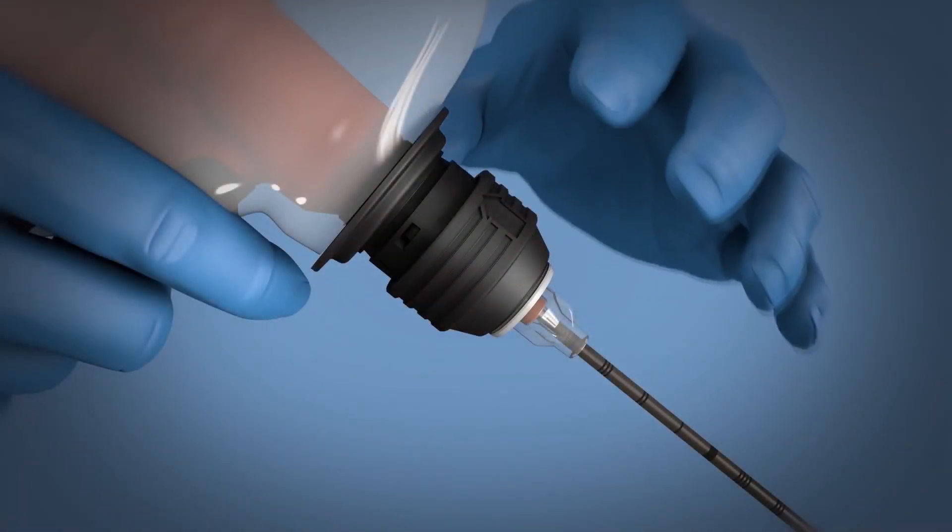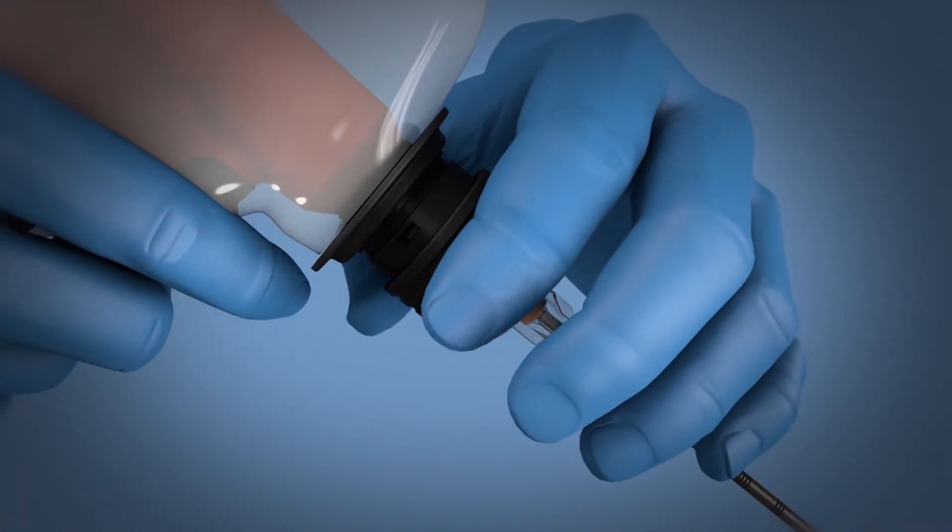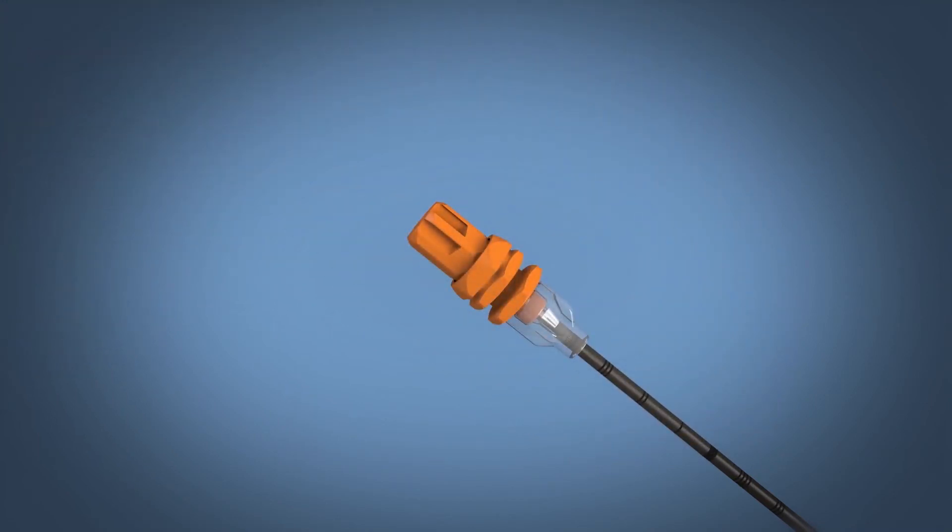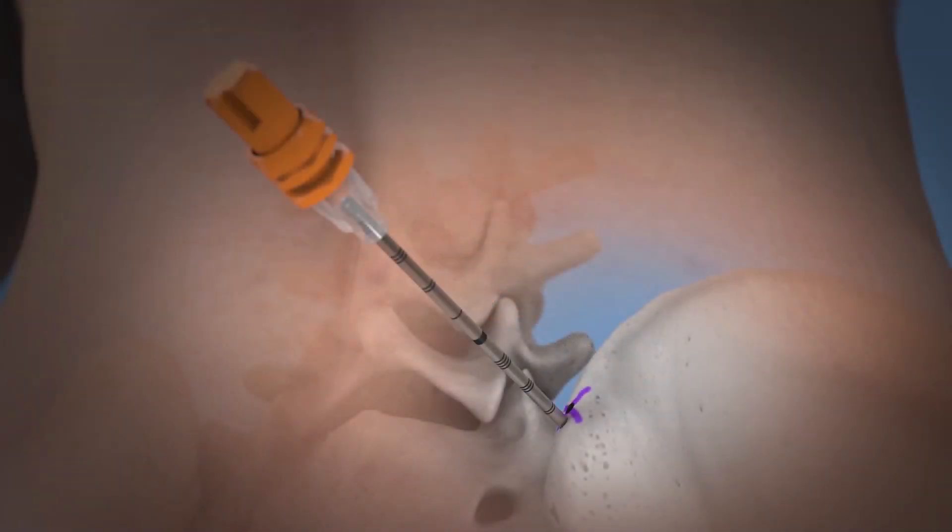Disconnect the driver from the needle by lifting up the black collar on the connector and lifting the driver up and off the needle hub without dislodging the needle. Gently twist and lift the stylet out of the cannula.